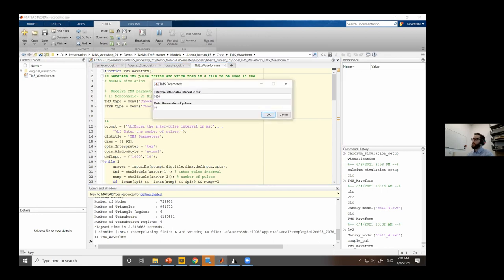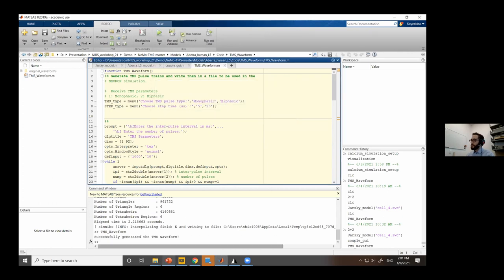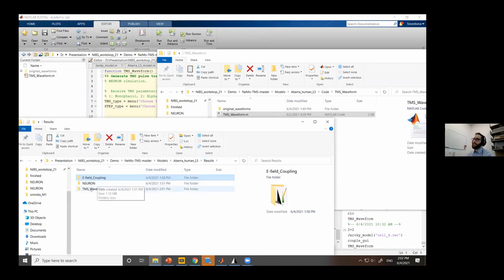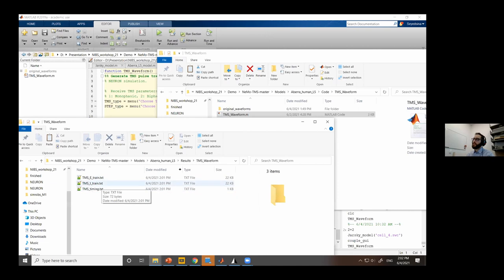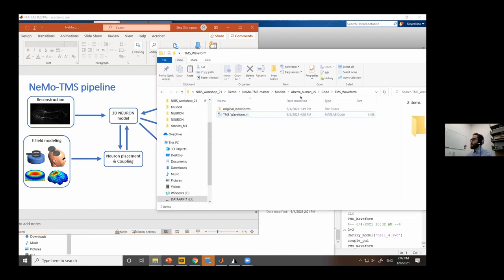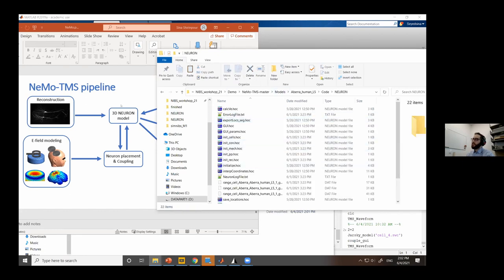You can specify the number of pulses and inter-pulse interval to set the rTMS frequency. I'll go with a single pulse for speed. After that, the TMS waveform files are generated in the results folder, and you're ready to run the neuron simulation. Go to code > neuron. Before running the simulation, set up parameters like synaptic inputs by running 'GUI_params'. It first asks whether to use uniform or realistic electric field — since I've done the coupling, I'll go with realistic.